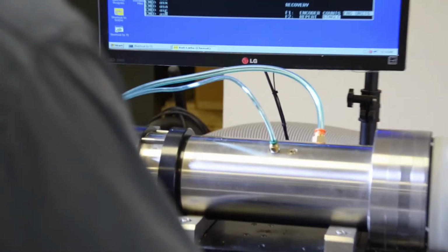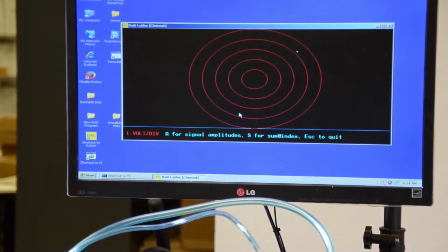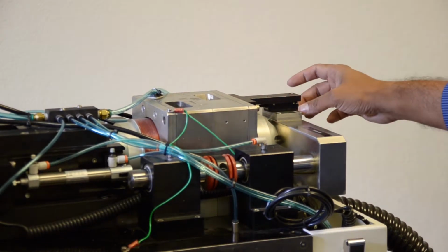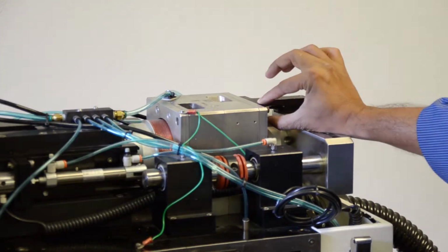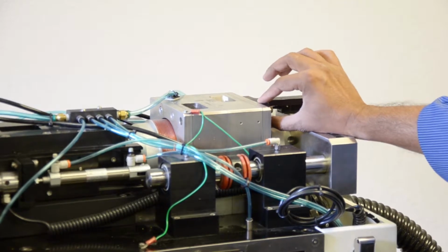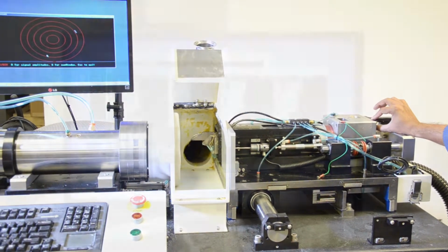So the signals I was showing you, like for RE axis, ASR, when I move this one, the signal moves. For some reason, if something happened and your signals crash, not coming out to be 4 or 3 volt, you have to adjust the signals from your encoders. You can either move this encoder, or you can move this mounting plate. You have to move very minorly, very small movements like in microns, because this is very sensitive in terms of moving.